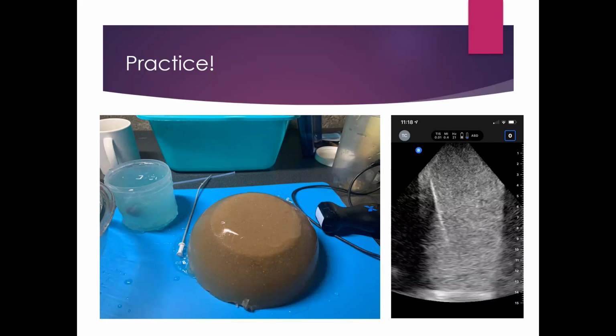And most of the time, the hydronephrosis is moderate or severe, so it was easy to succeed in placing this nephrostomy tube. Otherwise, for PCNL purposes, we never came across this procedure at all.